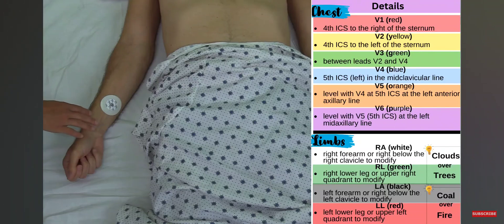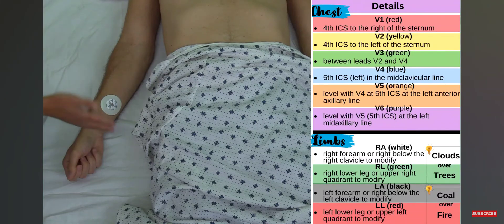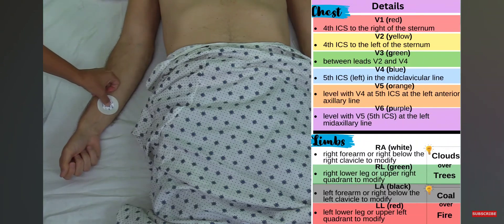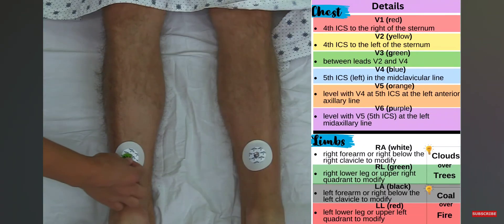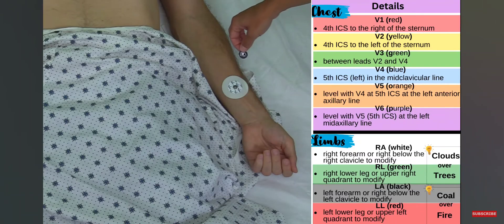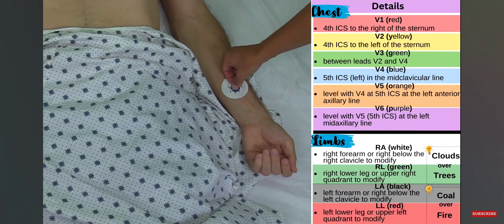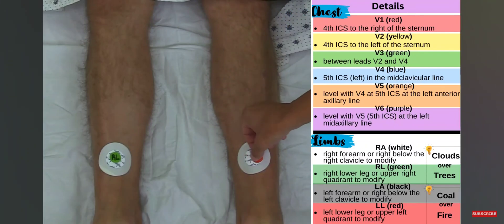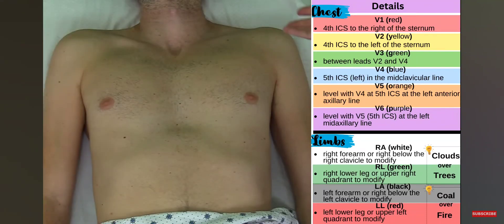Now that I've placed the limb electrodes, let me go over the limb lead colors you'll typically see. This can vary depending on the manufacturer, but typically: the right arm is white, clouds over trees which is green for the right leg lead, black for the left arm lead, and coal over fire which is red for the left leg lead.